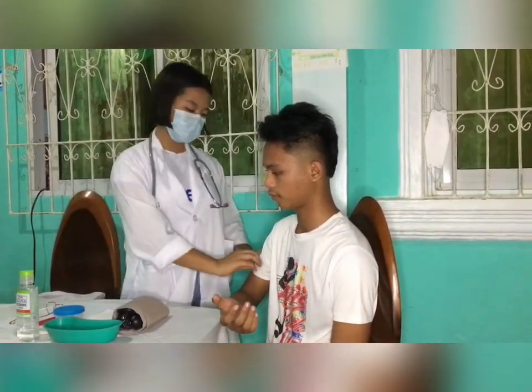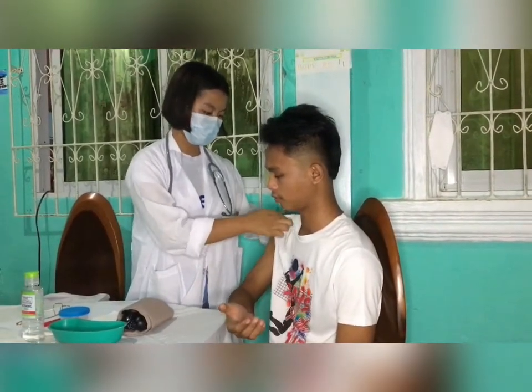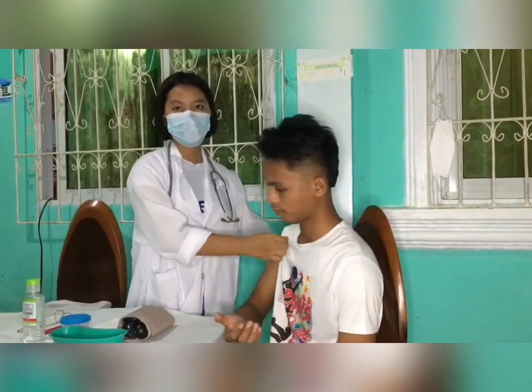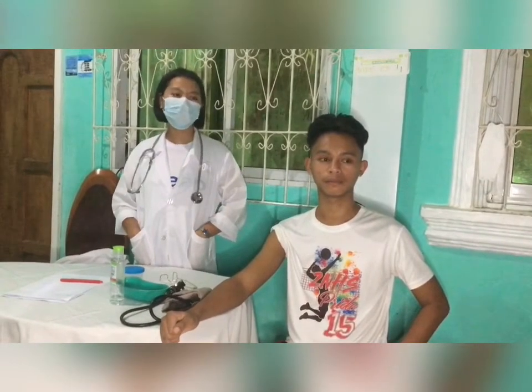Fold the patient's shirt sleeves or gown up to the shoulder, making sure it is secured and will not fall to the brachial area. Ask the client not to speak when BP is being measured.